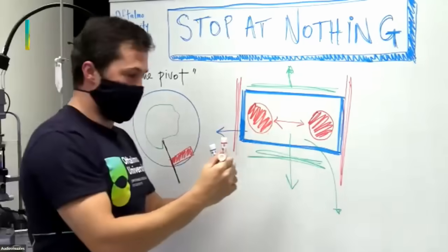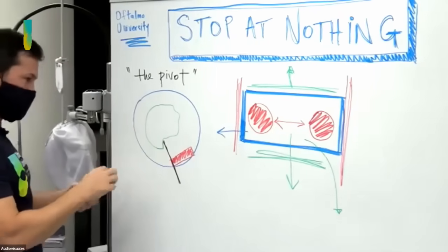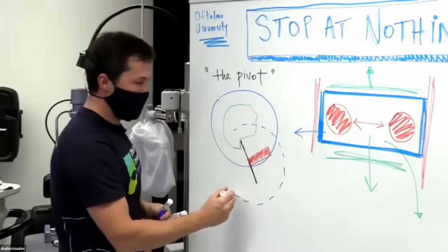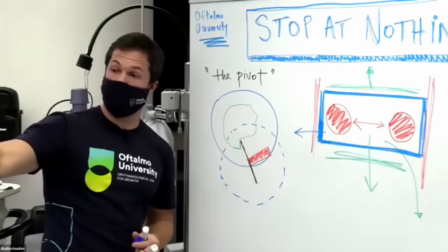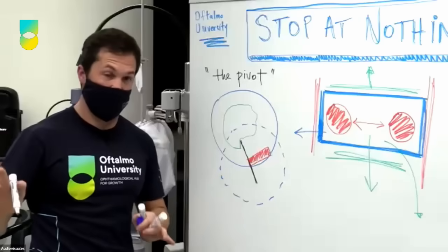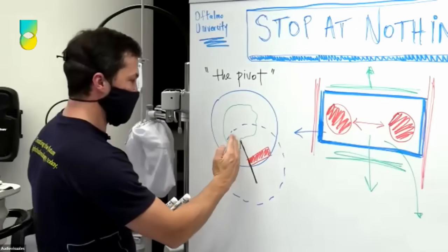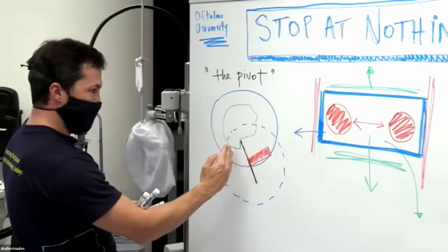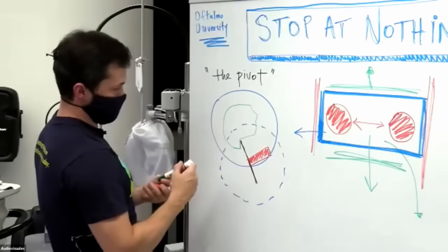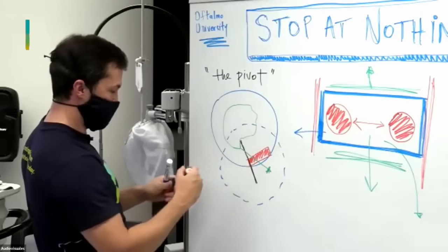And this concept that I love is extremely important just in this area. This area is the subincisional area, and we're going to see what the students are going to do now, because now they're going to have a moving eye. And that's going to be a problem for them. In this area, the subincisional area, the most common mistake is that they don't do the pivoting correctly, and the capsulorhexis can go out. Big problem.